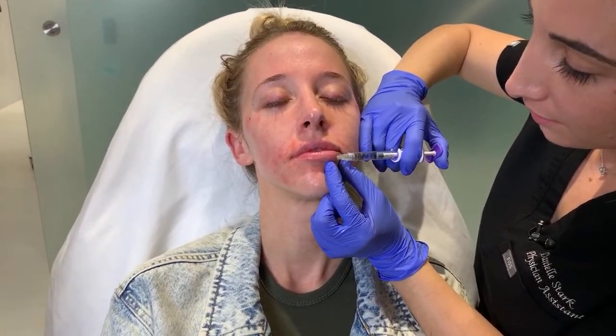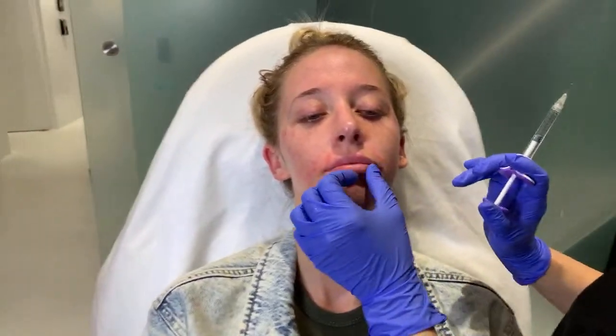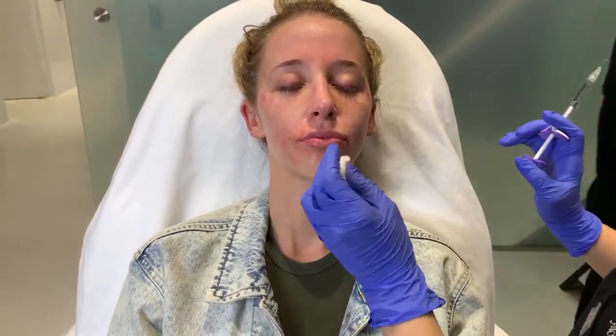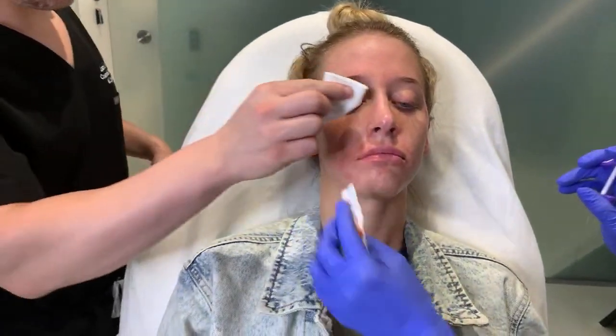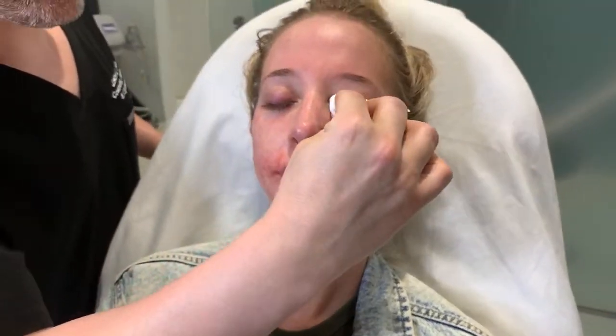Now, why did you choose Volure for her? So I wanted something that had volume but was still soft and not too much. She wanted to have the volume that she wanted, but without looking like they were pouty or overdone. Not that they would look overdone with a stronger filler, but some fillers just draw more water and they give you that full pout, and others don't. Let me clean you and take a peek. You can tell me if you want more size. Okay.